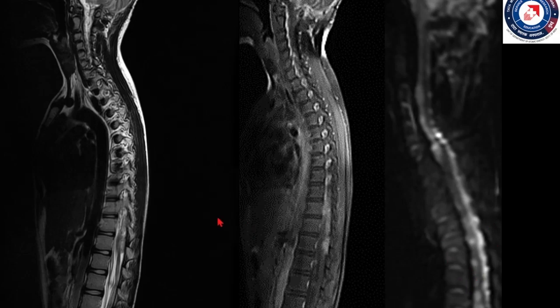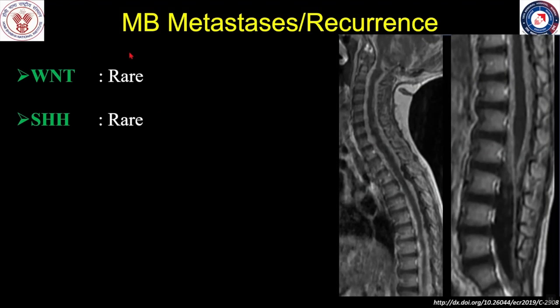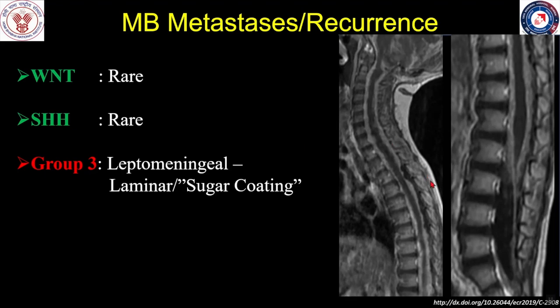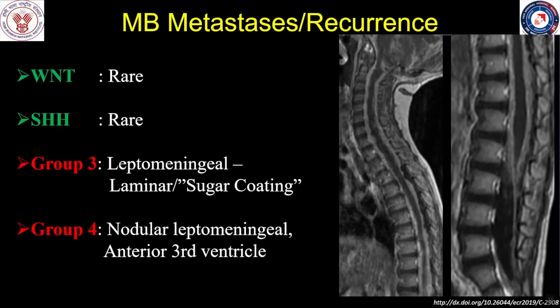Unlike the primary neoplasms which seldom enhance, the leptomeningeal metastases tend to enhance avidly. Metastases are quite rare with wingless and SHH subgroups of medulloblastomas. However, they are quite frequently associated with Group 3 medulloblastomas, which can show linear enhancement along the length of the spinal cord extending down the cauda equina nerve roots, giving a sugar-coating or laminar appearance. Group 4 medulloblastomas can present with nodular leptomeningeal metastases or deposits involving the anterior third ventricle or the suprasellar cistern.